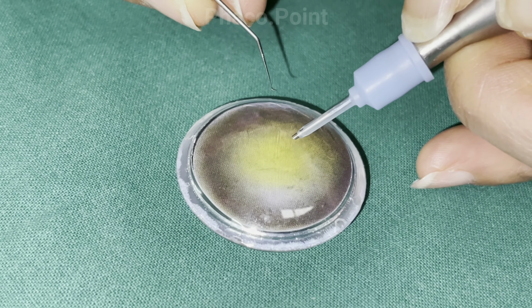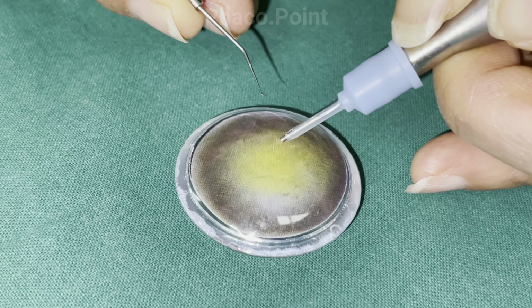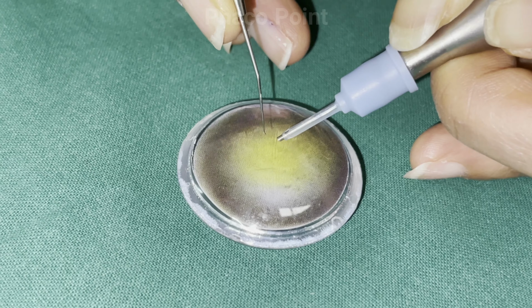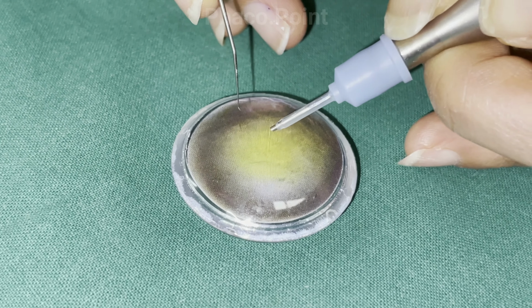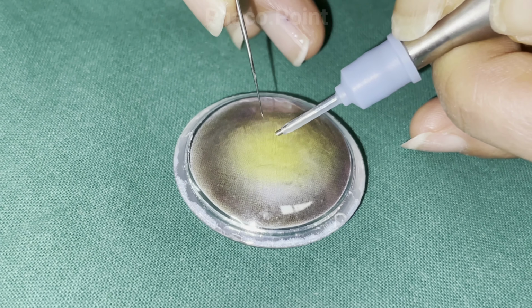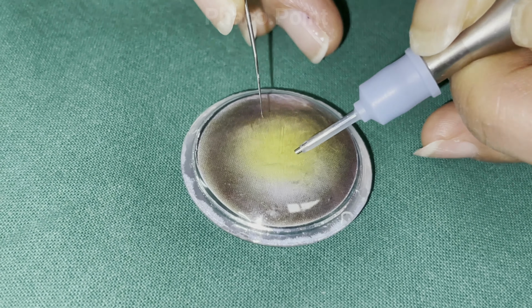So once you get to the right depth in 3, foot pedal in 2, impale the nucleus, you lift up the nucleus and confirm fixity into the tissue. Then it is the job of the second instrument to impale into the nucleus just beyond and lateral to it, while maintaining the hold of the nucleus with the phaco probe in foot pedal 2. The second instrument, which is your chopper, is held in a vertical position and impales into the nucleus just beyond and lateral to the tip, and both instruments now are moved apart.